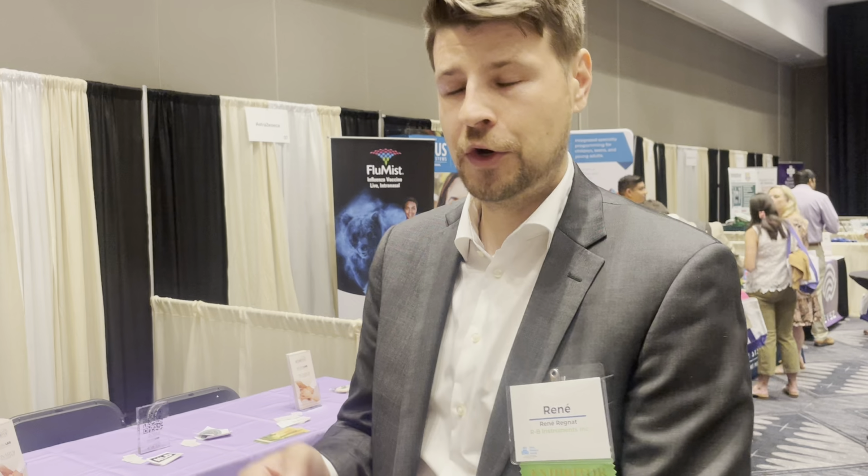Since we do visual acuity testing on it as well, we could use 2 CPT codes: 99177 for instrument-based vision screening, on-site analysis, pass refer, and 99173 for visual acuity. Not billed together, but you can use both codes with that device. The investment may look like a lot in the first place.